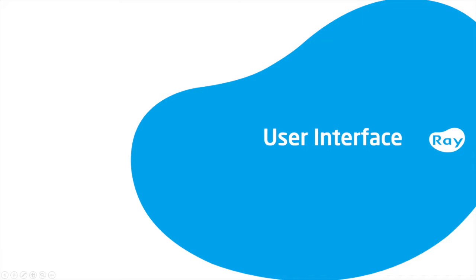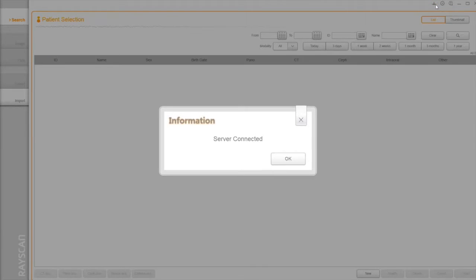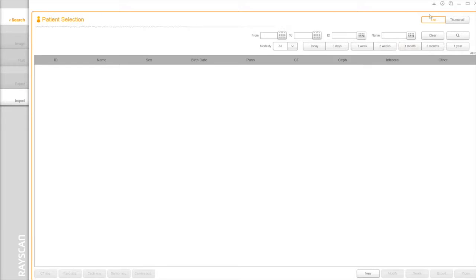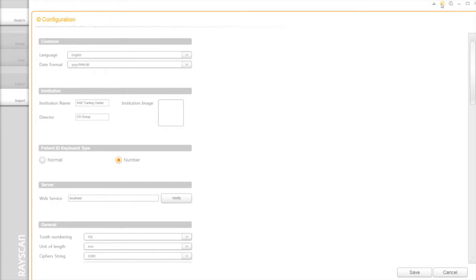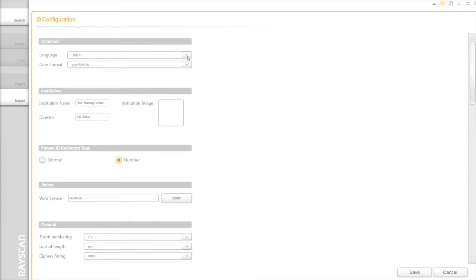User Interface. Once you launch SmartDent, you can do the server connection test. Right of that, you have configuration. By clicking, you have a variety of options for your practice. First, you can choose the language and also change the format of a date.